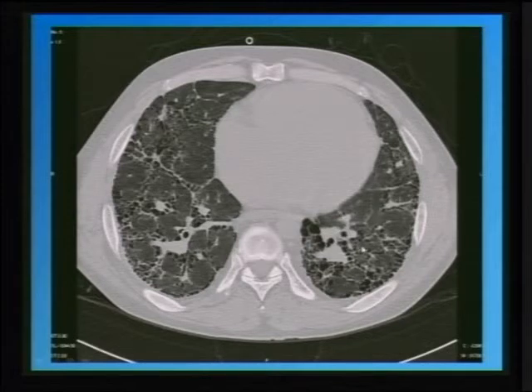Of course, here in this patient, you see some honeycombing and some distortion. But also, you need to appreciate this diffuse increased ground glass opacity due to diffuse pulmonary fibrosis. Now, in the right setting, you have to be able to differentiate the cause: is this IPF, idiopathic pulmonary fibrosis, meaning UIP, usual interstitial pneumonitis, or is it non-specific interstitial pneumonitis?